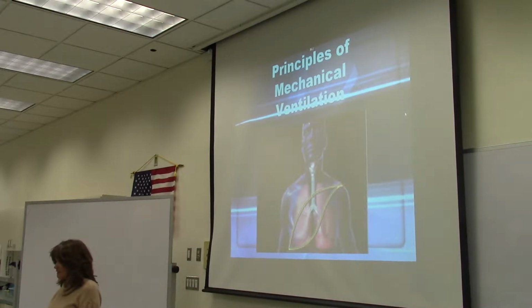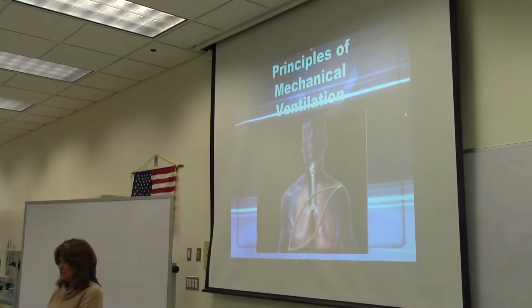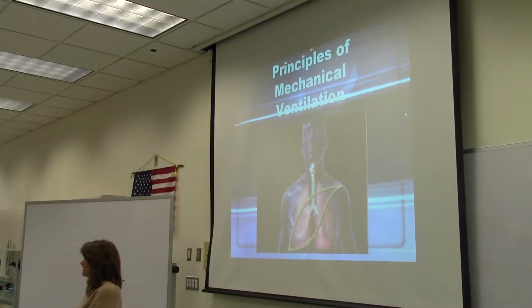As far as people needing a ventilator, what is the primary function of a ventilator? I have some notes for you to write down before I start with the PowerPoint. The primary function of a ventilator, and there's two. The first one is to ventilate, and it's to get air in and out of the lungs.